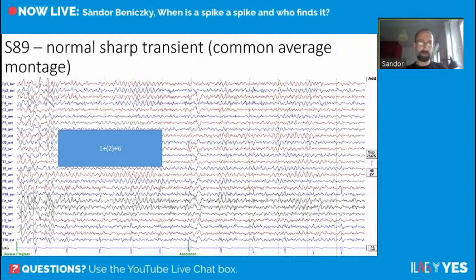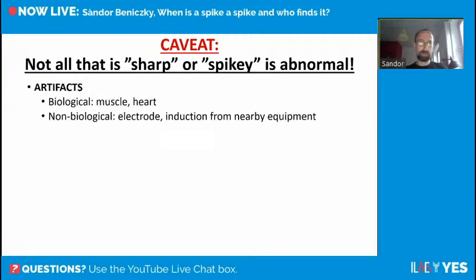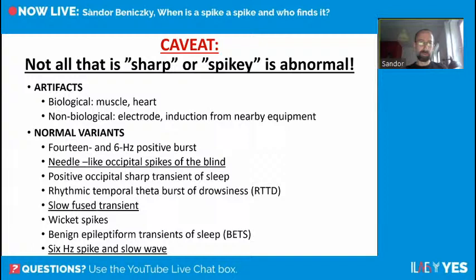Another spiky phase reversal in bipolar montage that many neurophysiologists would call abnormal. In common average montage you can see it's spiky and has a voltage map, but it lacks the other criteria. This does not fulfill the criteria set even though it fulfills some individual criteria.